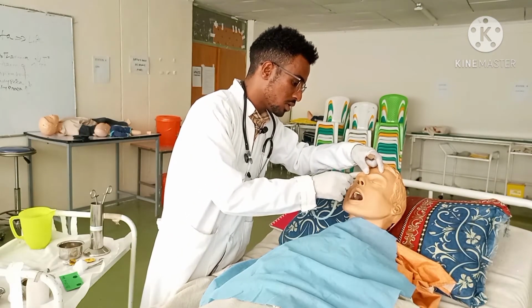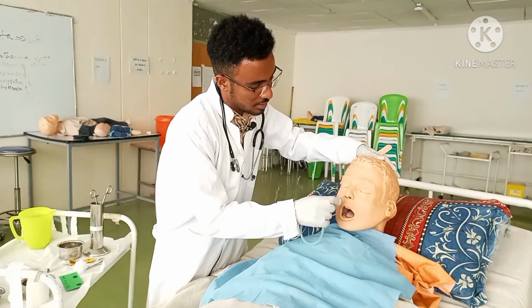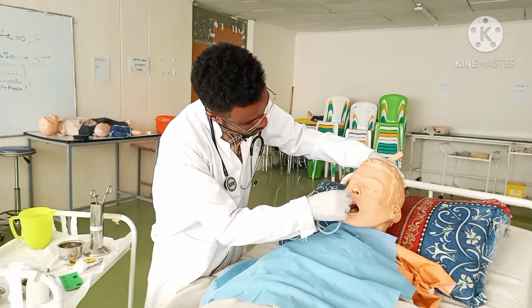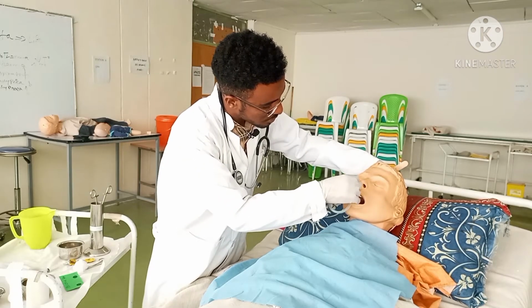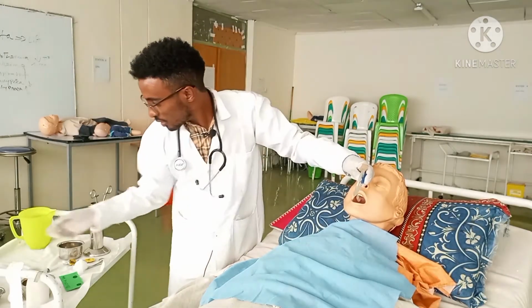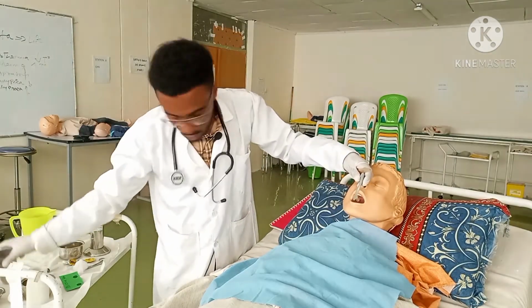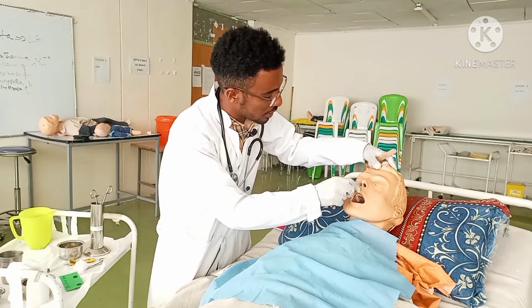Please swallow. After inserting up to the nasogastric tube, flex the head. Advance it slowly. Mr. John, could you feel any discomfort? Could you swallow? Please swallow. If the patient can't swallow, or has a dry mouth, bring a glass of water and allow him to swallow. Observe your patient for respiratory distress.